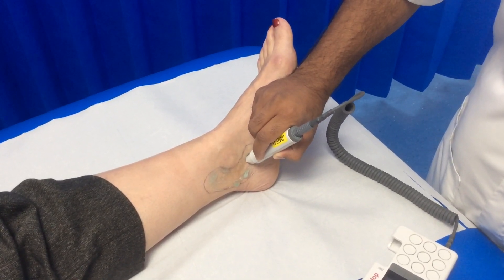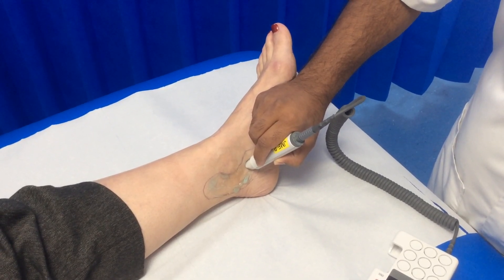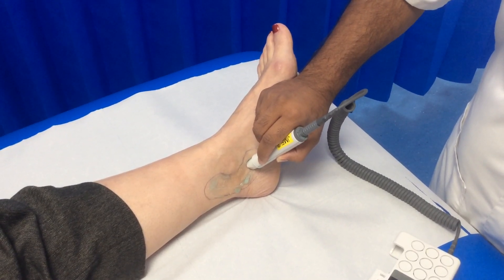Once you've found the pulse, adjust the angle of the probe, usually between 45 and 60 degrees, with the probe facing towards the heart.